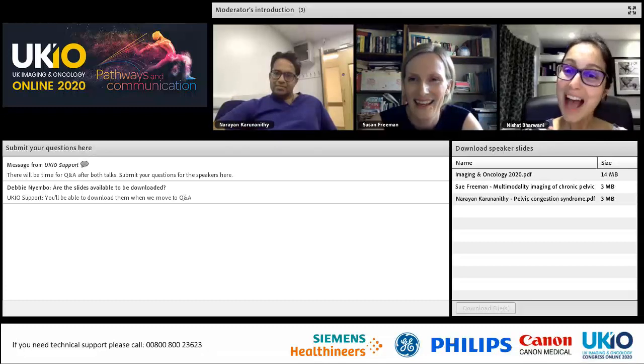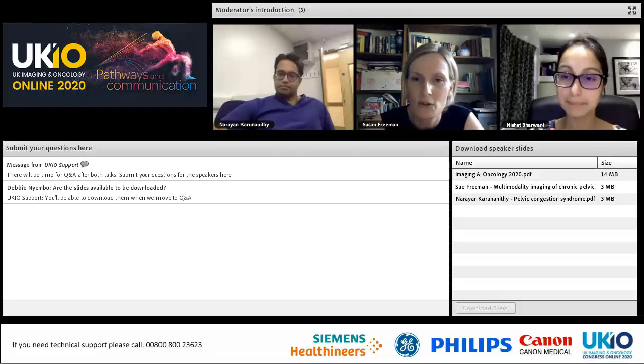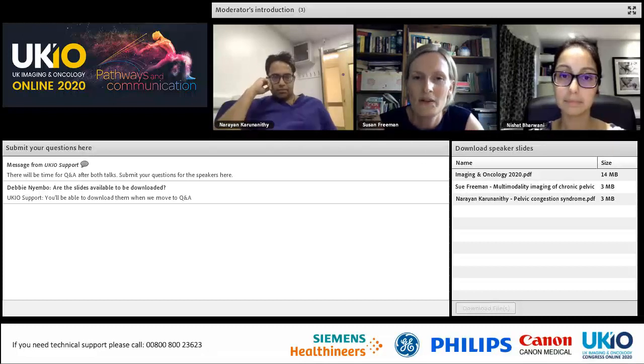Another question for you, Sue. Would you be able to give an idea of what your MRI protocol for endometriosis is? The MRI protocol for endometriosis? Yes, so we would do 3-plane T2, so sagittal, axial, coronal. I know some people like to do an axial oblique so that they can go along the torus uterinus, but we find that just for uniformity, it's just easier to do a straight coronal, and then T1 and T1 FAT-SAT. Because we don't supervise our scans, pretty much all our patients will get DWI as well, which is of some help.